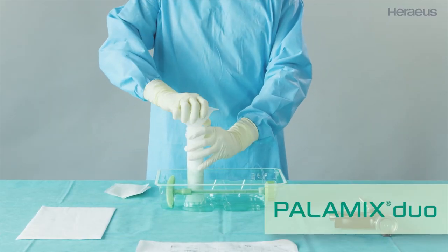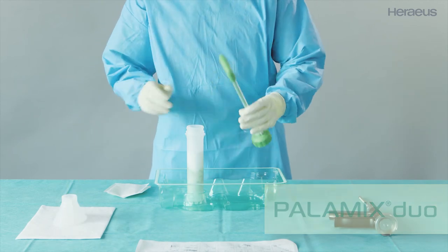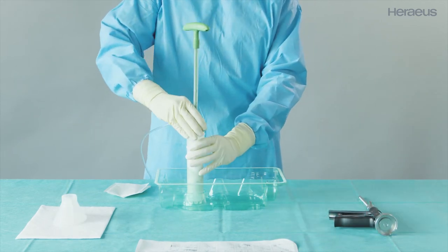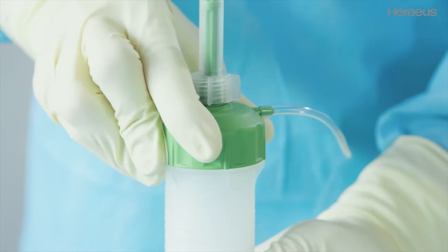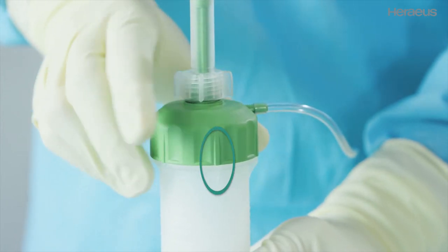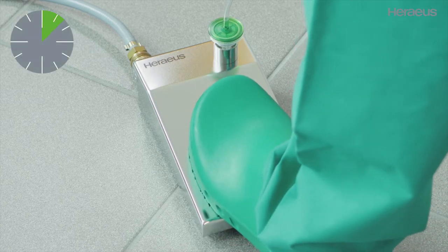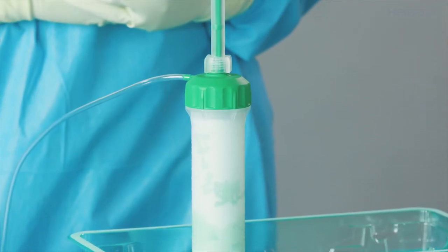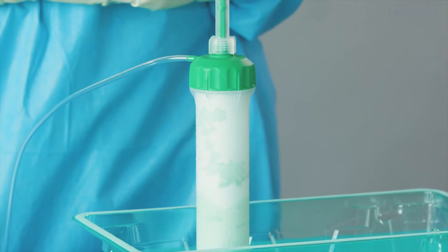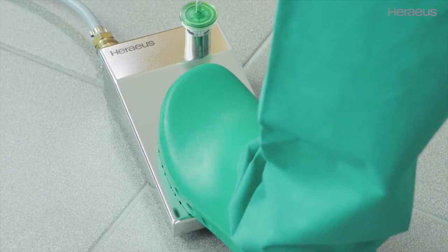When using Palomix Duo, remove the funnel and set it aside in the sterile area. Place the cap with retracted mixing rod on the cartridge and screw it on tightly until it stops. Make sure that the ribs on the cap and the bars on the cartridge are aligned one above the other. Activate the Palomix vacuum pump for at least 10 seconds. The vacuum generated can be seen in the cartridge, and the vacuum pump remains activated throughout the whole mixing process.